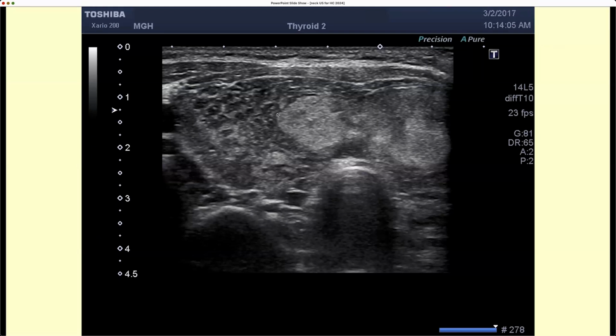It's a solid nodule. Go ahead. Seems to be, I don't know, there's a defined border, but it cuts off on the right upper corner there. Right. Yeah, so it looks like it's a background of thyroiditis, so it might be part of the autoimmune process, like a white kind of nodule. Right, and so in that setting, this is a nodule that is called a white knight nodule, and it's a nodule that is benign. It can be ill-defined, but it's a pattern that we recognize as a benign pattern.